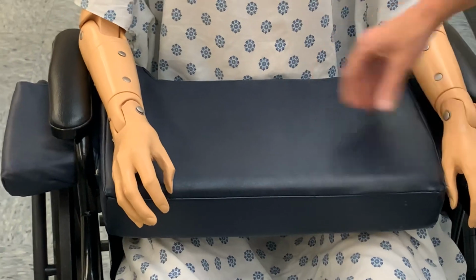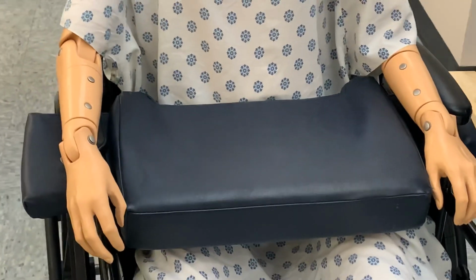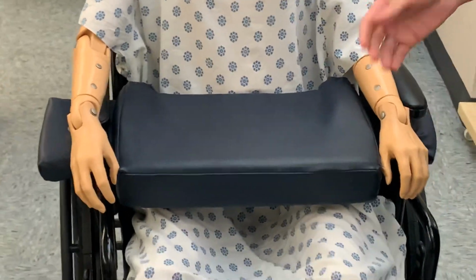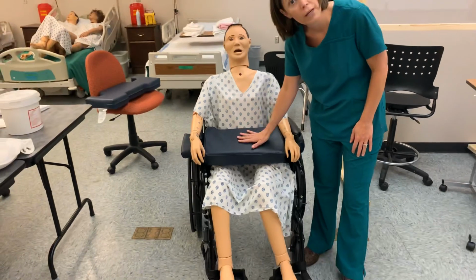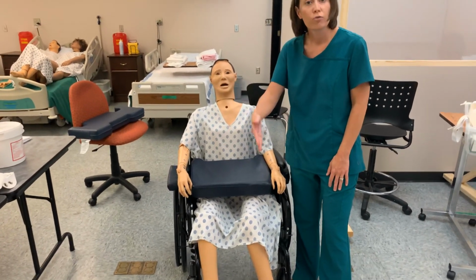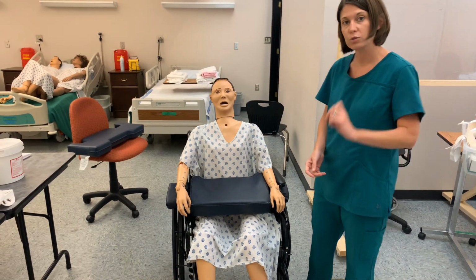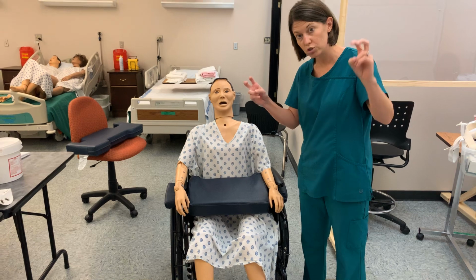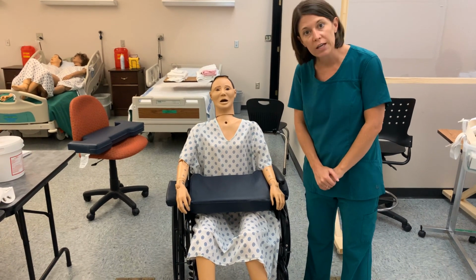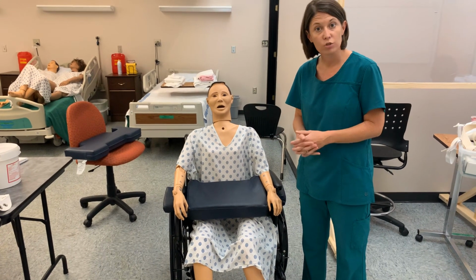This is considered a restraint in that it would prevent my client, if they tried to stand up from the wheelchair, this would be in the way. So it is restraining them, it is preventing them from getting up and in some cases from falling. Now, the thing to always remember, a restraint is only a restraint if it is preventing my client from movement that they normally have to begin with.